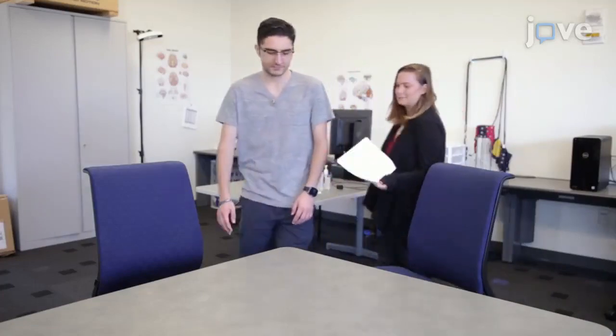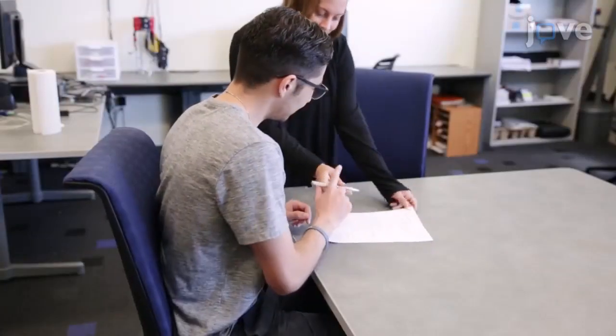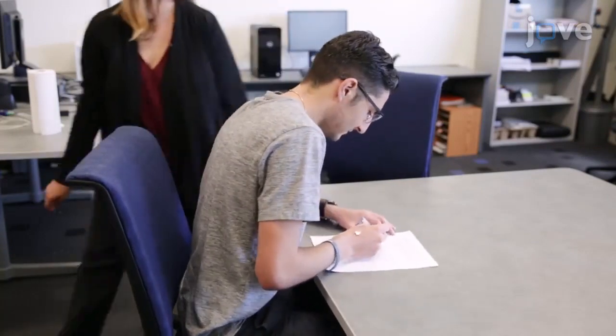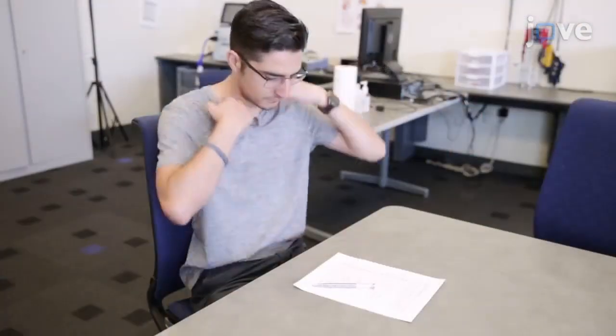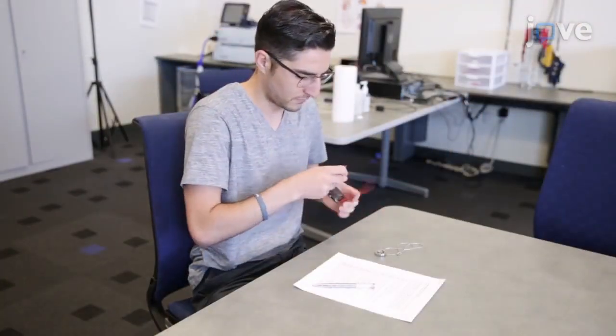Begin by seating the participant in the testing room and go over in depth with them how TMS works and all potential side effects. Have the participant fill out the TMS safety screen to ensure that they have no pre-existing factors that cause adverse effects. Make sure to remove all metal jewelry or accessories.